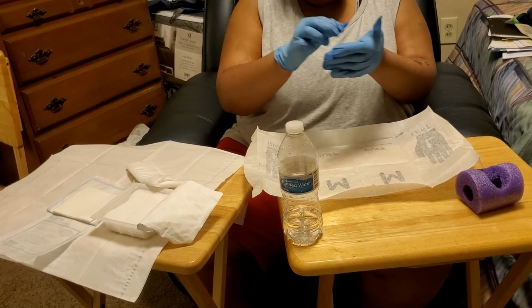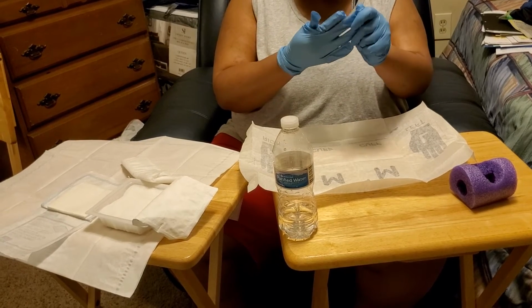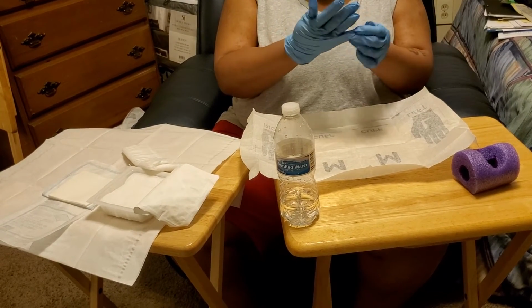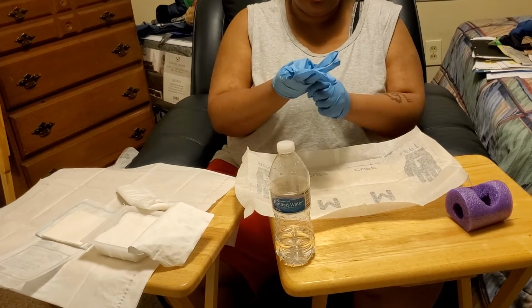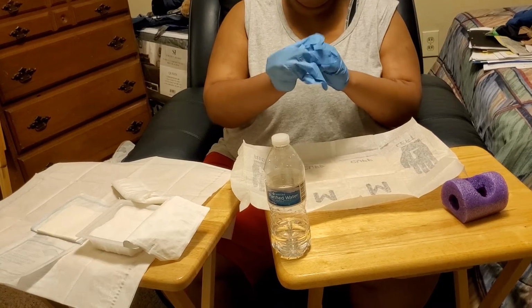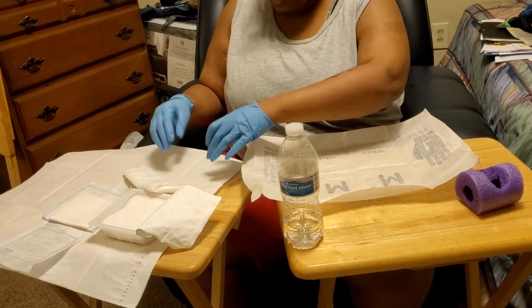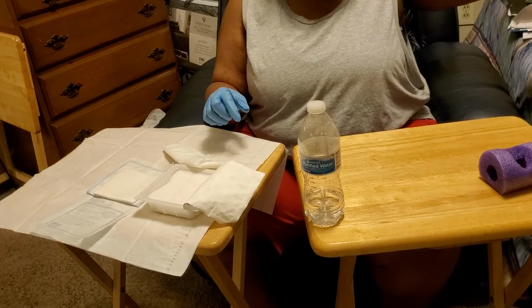Okay. I want to fix my fingers in this glove. I believe it is placed on sideways. Alright, so I didn't turn it to where the thumb goes in. So I want to fix that and just make sure that I'm still in my sterile area. Okay, so this is my sterile area, and I dispose of that.